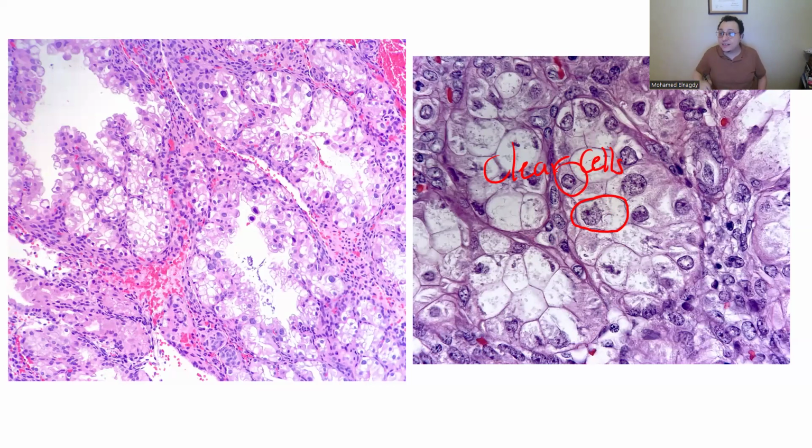So you might say this is clear cell carcinoma. Actually, with this degree of pleomorphism and atypia, I might say this is clear cell carcinoma. In the low power, this looks really ugly, really like a cancer. But the cells are irregularly shaped, as you mentioned. There's some hobnailing, some irregular arrangement, which looks like clear cell carcinoma, but in a reproductive age female, not old age.